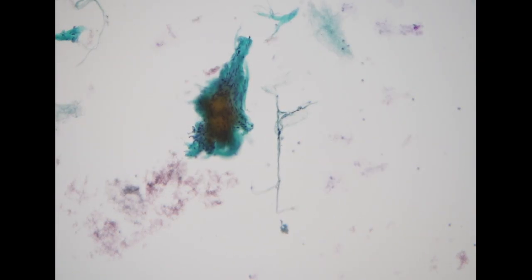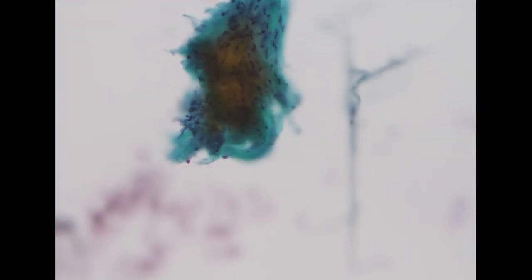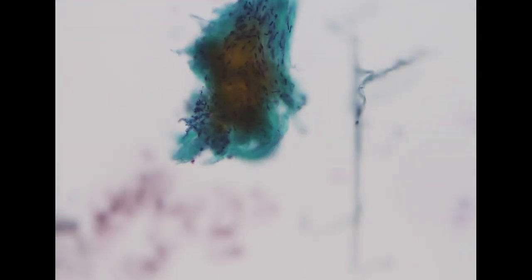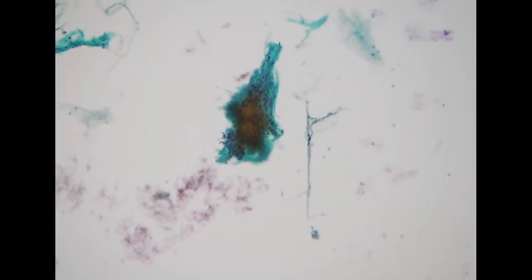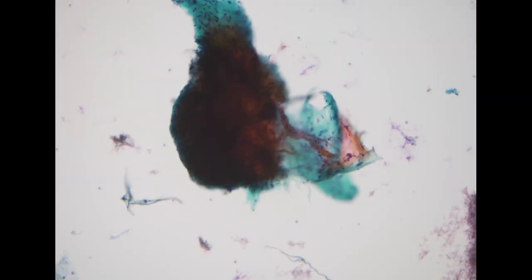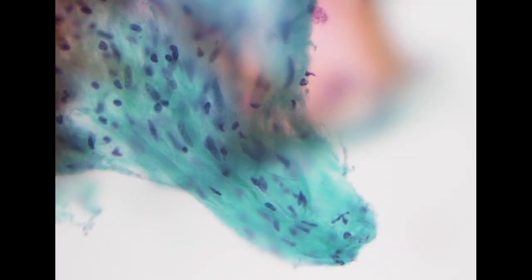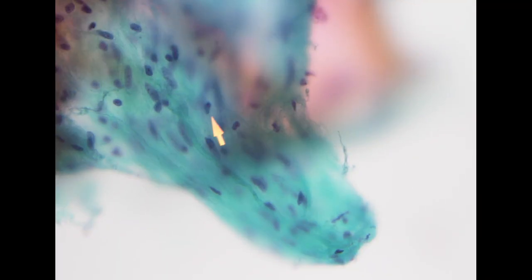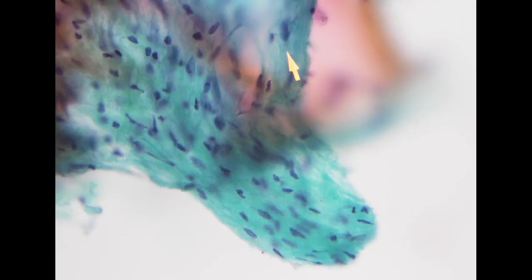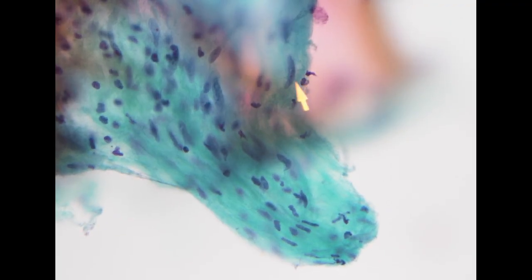So for this specimen, we identify cellular fragments, which are composed of mostly spindle cells with dense extracellular material. So when we go to a little bit higher power, the cells have this sausage shape, some with a more curved shape.